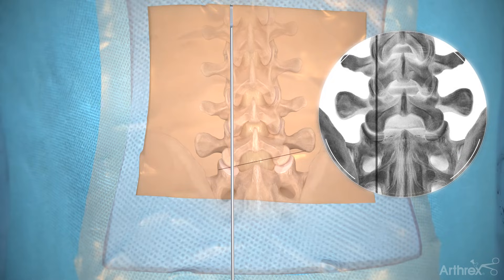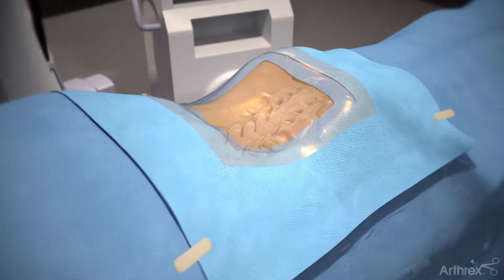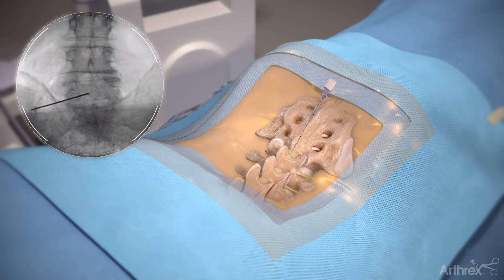Using an elevator and AP fluoroscopy, find the vertical line through the ipsilateral facet. Mark the entry point where the horizontal and vertical lines intersect. Insert a spinal needle and locate the docking point of your endoscope cannula at the spinal laminar junction on the ipsilateral side.